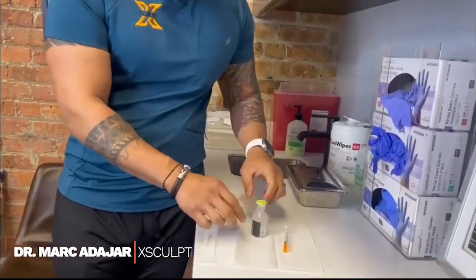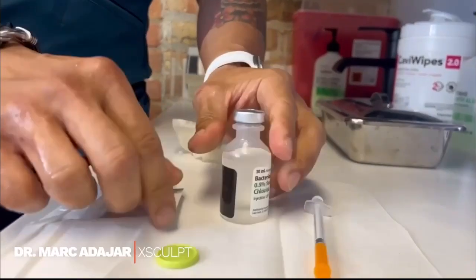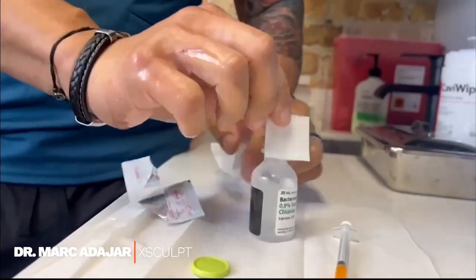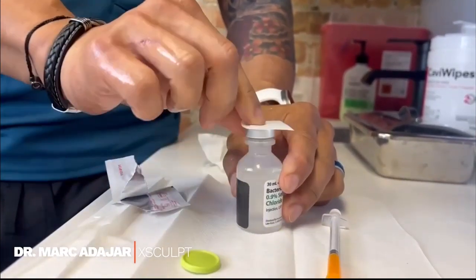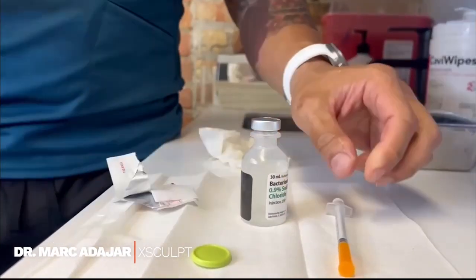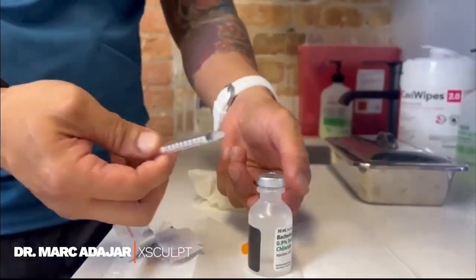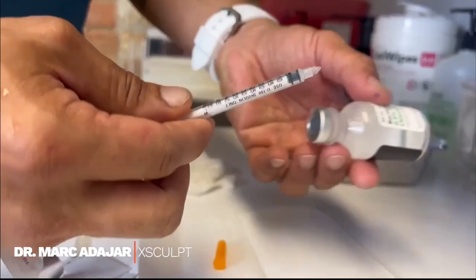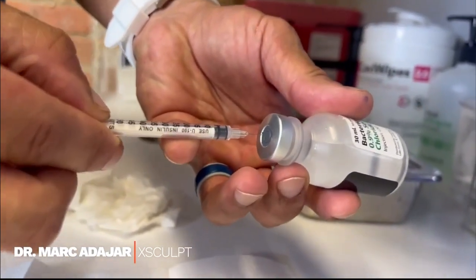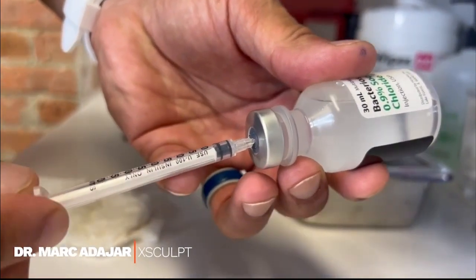For your very first vial, you pop out this top. You take your alcohol pad and you wipe the top of it, because this is not sterile — the contents are sterile, but the top is not. Now you'll take your subcutaneous injection syringe and insert it right into the middle of the top.